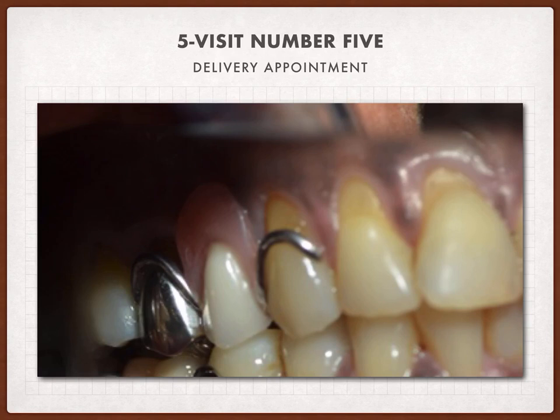These things are important to tell the patient so that he will not worry about the abnormal function, phonetics, excessive salivation, and pain that he may face while wearing his denture.